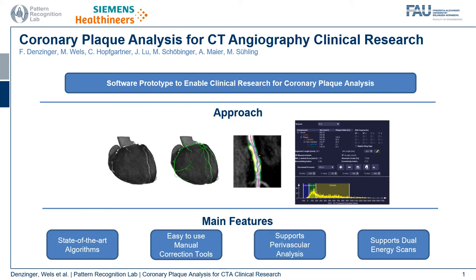After a segmentation of the heart, the centerlines of the coronary vasculature are extracted in order to enable a region of interest selection and a segmentation of the inner and outer wall in that region of interest, in order to analyze plaque deposits in the coronary vasculature.